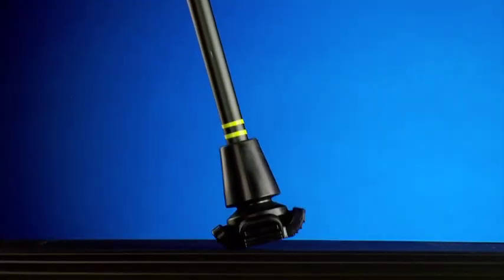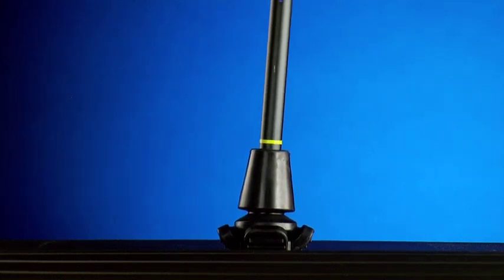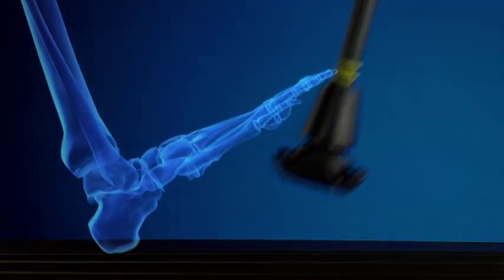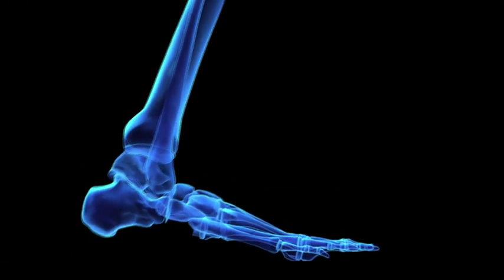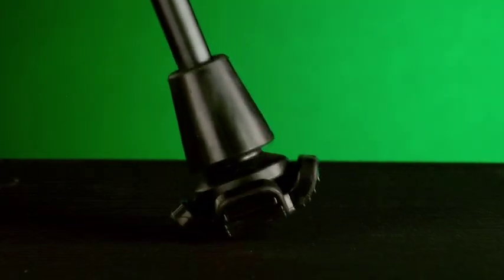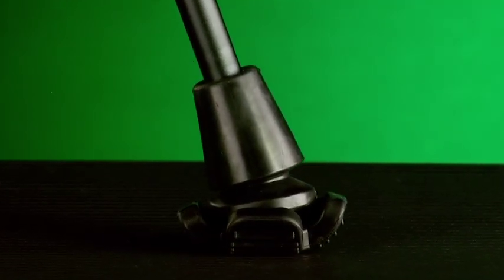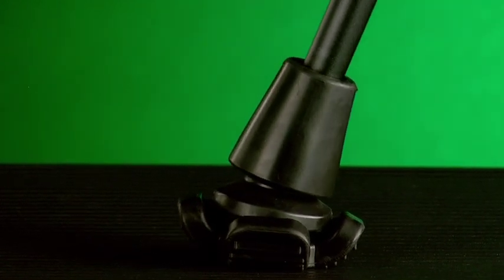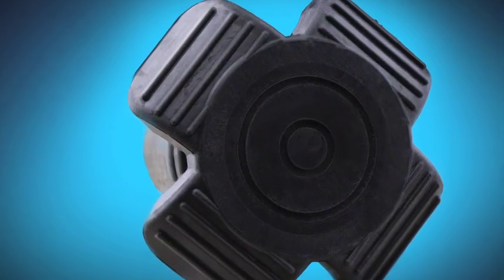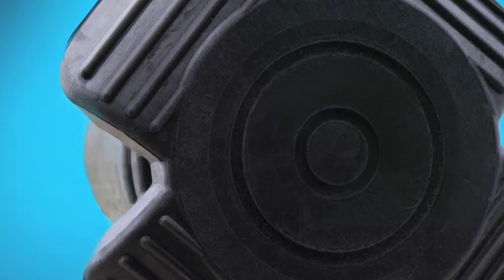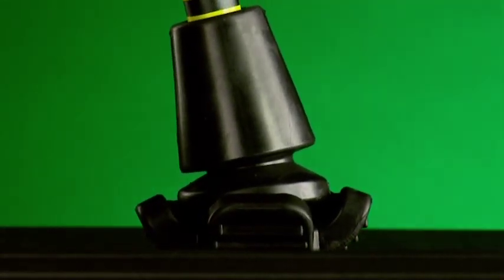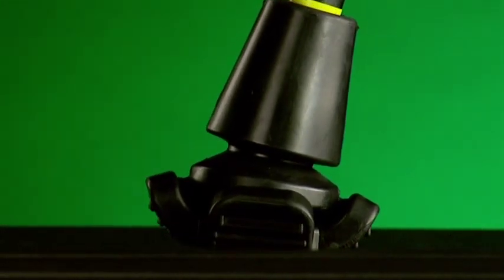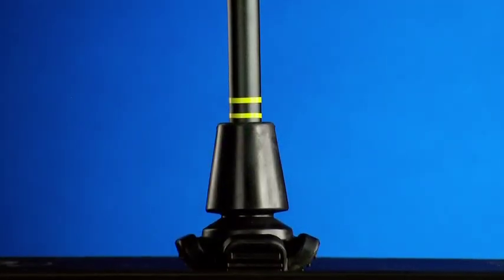To begin, the Ergobomb's unique patented end cap is a piece of engineering that simulates the ankle's joint. When the crutch lands and makes contact with the ground, it adapts to it to provide a more secure and stable grip. The crutch cap is made of a special anti-sliding rubber material, becoming the first barrier against the impact and vibration.